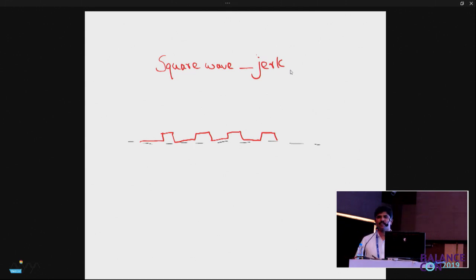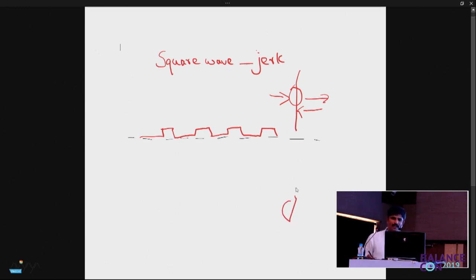What is a jerk? A jerk is something where, from where I am standing, if you push it in one direction, it goes there and then it comes back to where it is. Versus an oscillation, which is a typical pendulum: it goes to both sides and comes back.